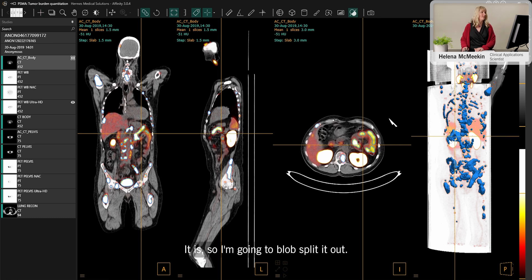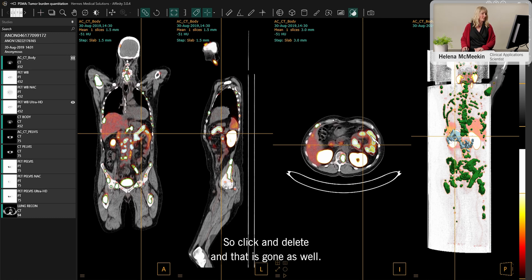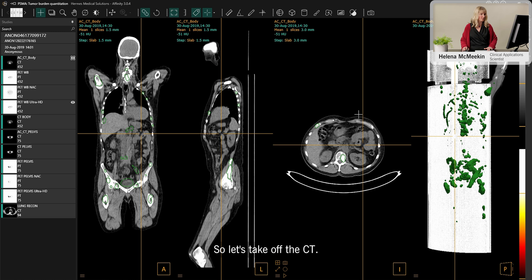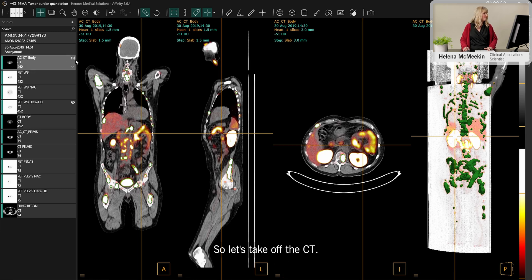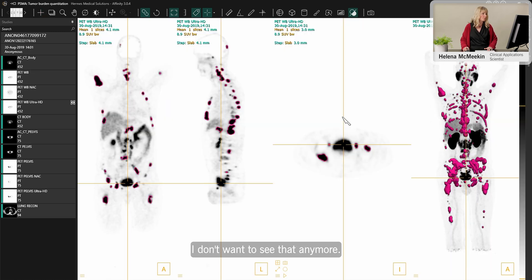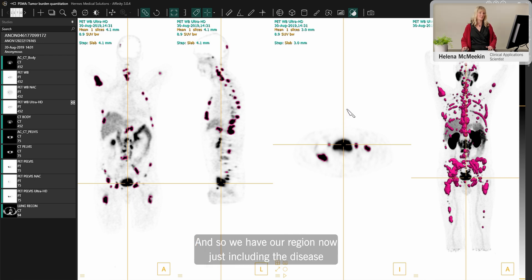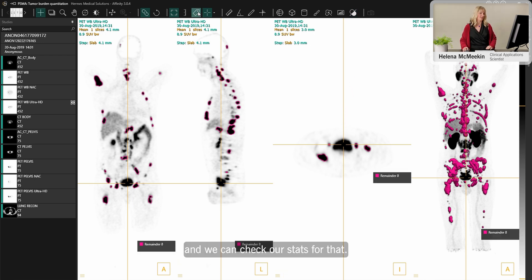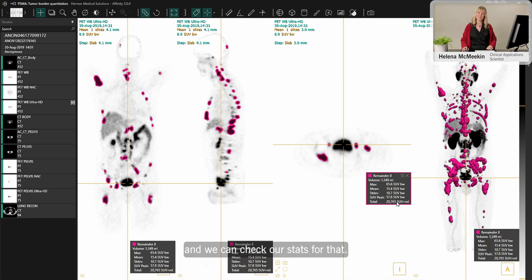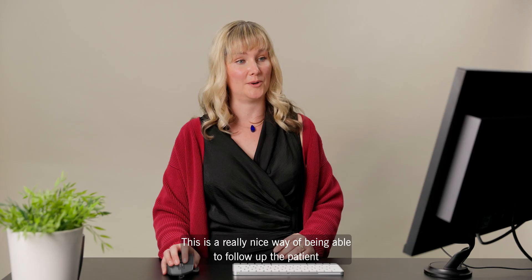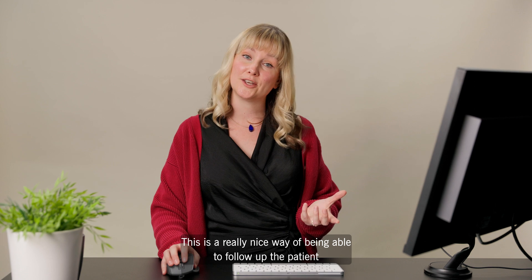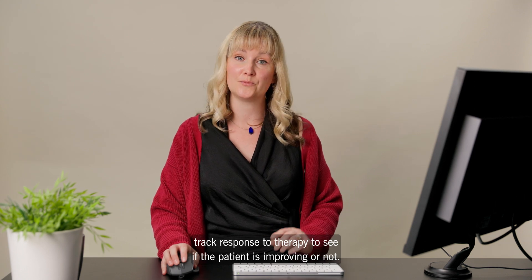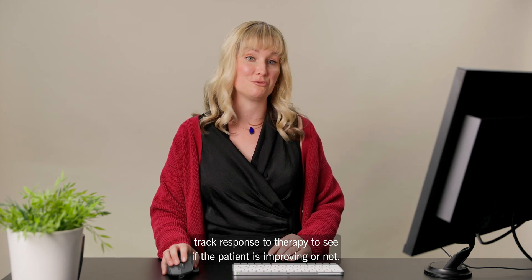Checking the fusion confirms that the uptake is part of the large intestine, so we blob-split it out with a click and delete. We remove the CT overlay, and now our region includes only the disease. We can check our stats — this is a great way to follow up the patient and track response to therapy, seeing whether the patient is improving over time.